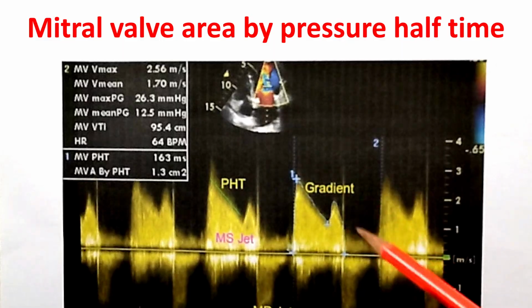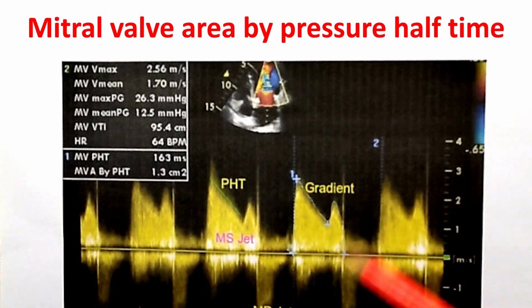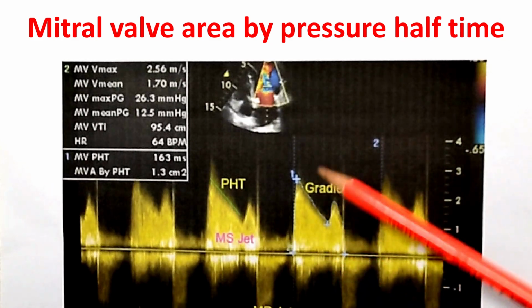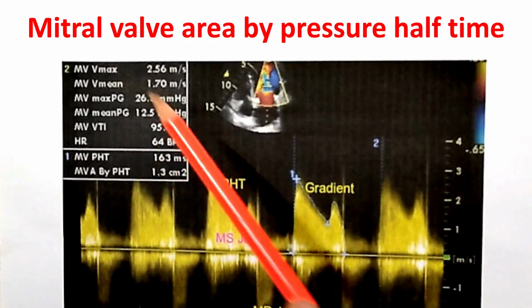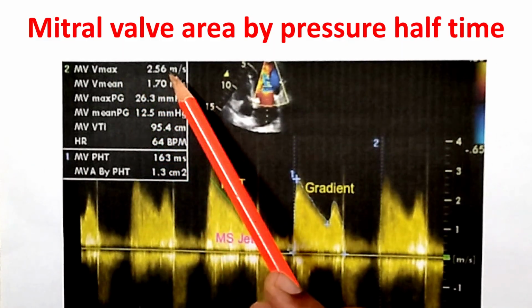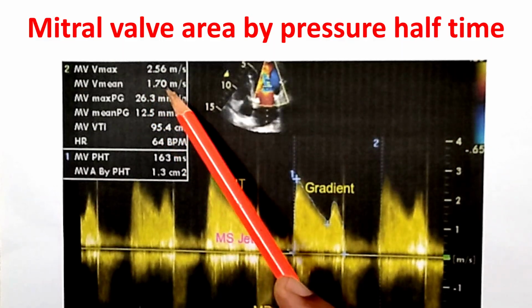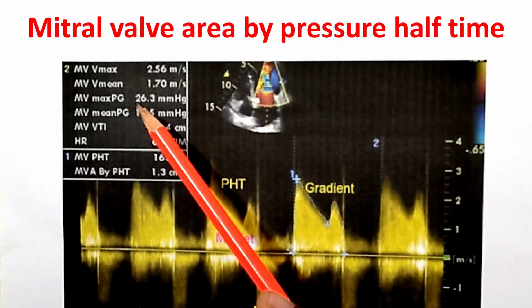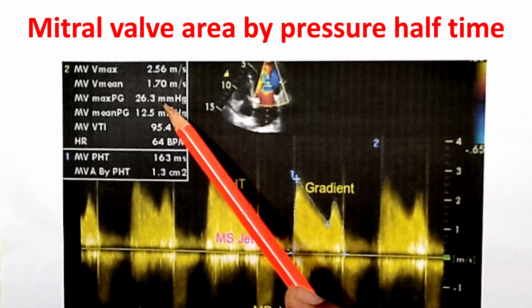This is measurement of mean gradient by tracing the envelope of the mitral inflow Doppler. Here you can see that maximum velocity is 2.56, mean velocity 1.7, and peak pressure gradient is 26.3.